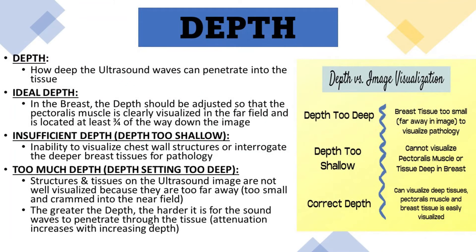The next ultrasound control that I adjust is depth. Depth is how deeply the ultrasound waves can penetrate into the tissue. Ideally in the breast, the depth should be adjusted so that the pectoralis muscle is clearly visualized in the far field and is located at least three quarters of the way down the image.